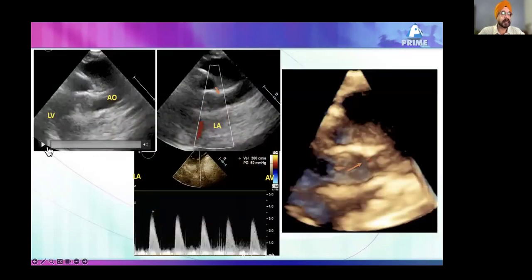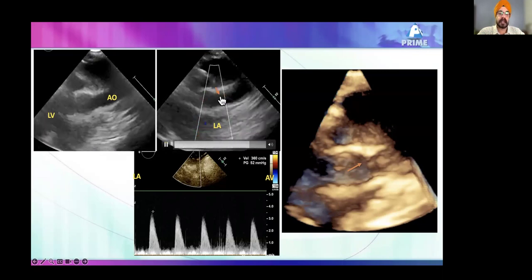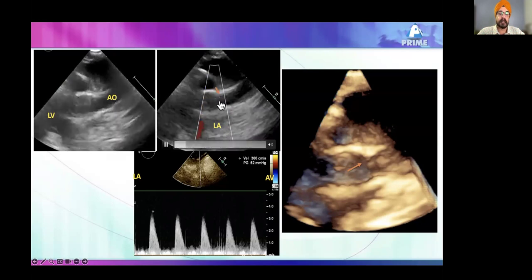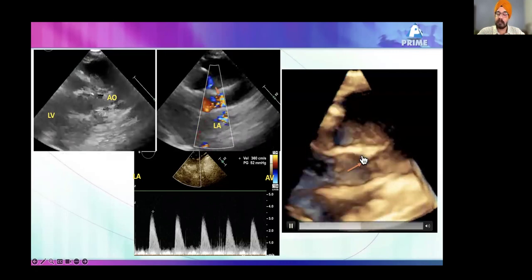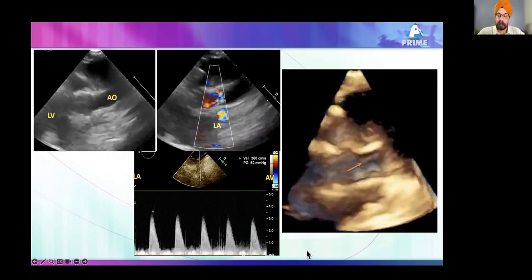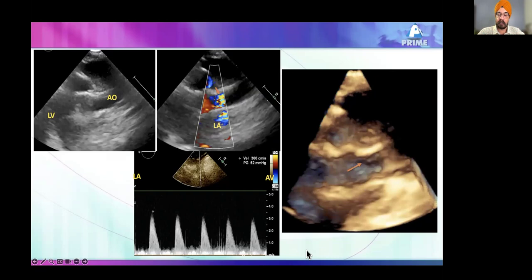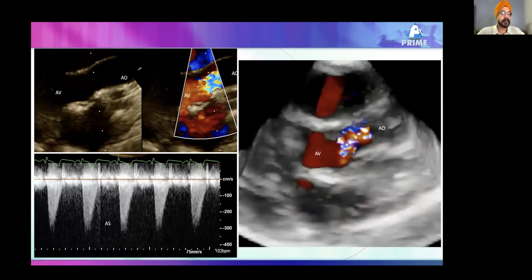That was very uncommon stuff, but I'm showing you a patient with a kind of tubular aortic stenosis starting from here. This is supravalvular. Aortic valve was normal. The sinus of Valsalva is fine, and you just get aliasing right here just above the sinotubular junction, and then you see this hourglass kind of obstruction, and the velocity was about 3 meters per second. This is a supravalvular aortic stenosis. This patient had Williams syndrome on the genetic workup.